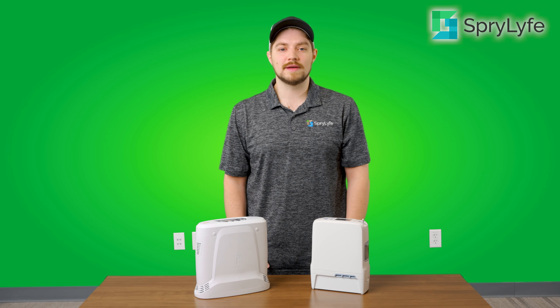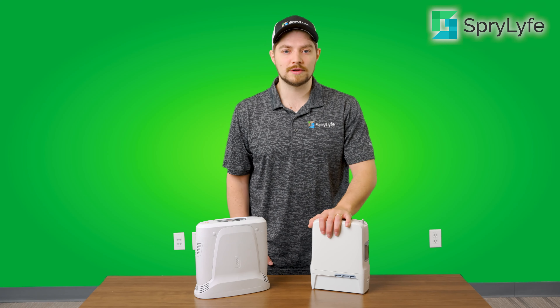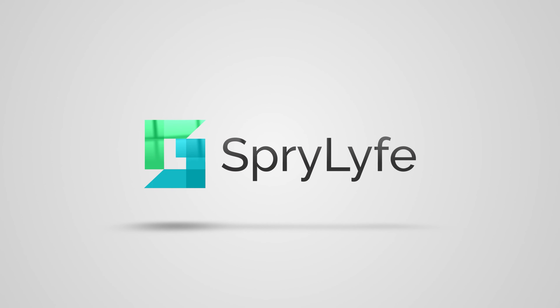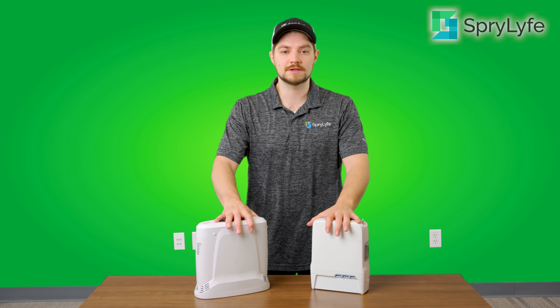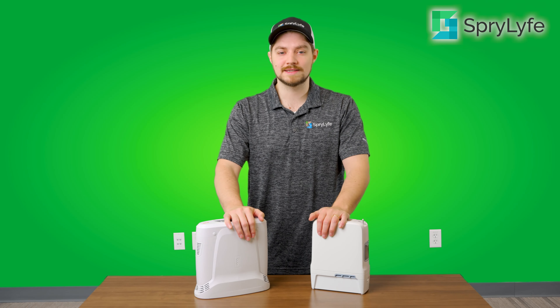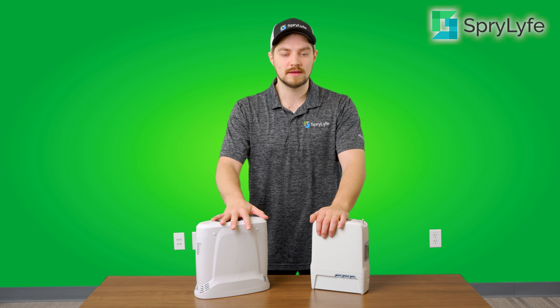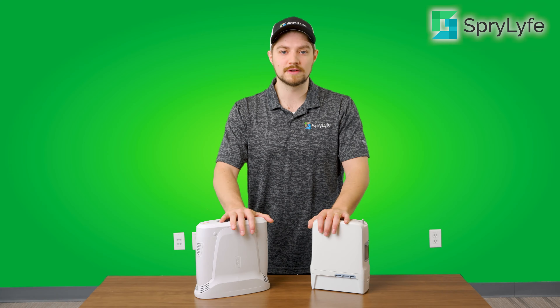Hey everyone, this is Cody from Sprylife Medical. In today's video, we're going to be doing a comparison of the Inogen 1G5 as well as the GCE Xenolite. Both of these machines are portable oxygen concentrators. They are both very lightweight and can be thrown right over your shoulder so you can carry it just like a tiny bag or a small purse, making it very easy to be portable with. We're going to be going over some specifics so that you can decide which unit is going to work best for you.